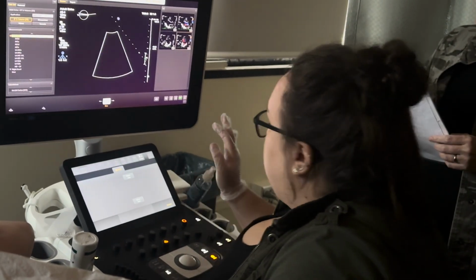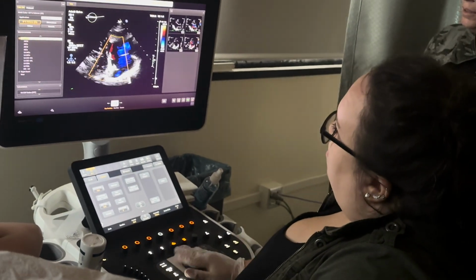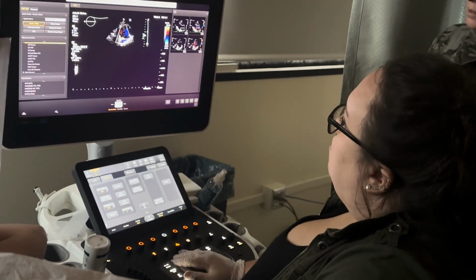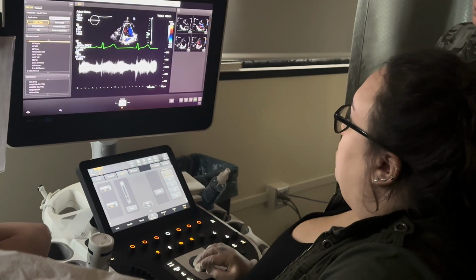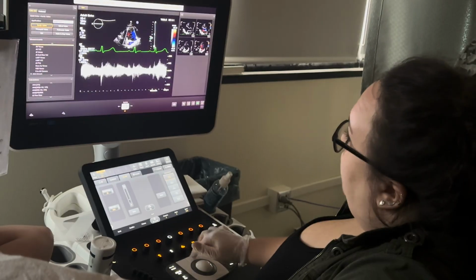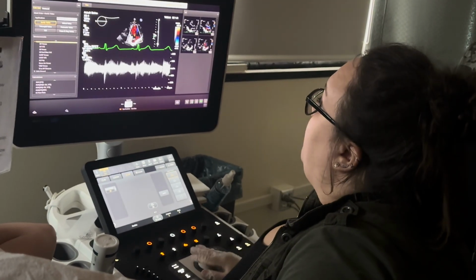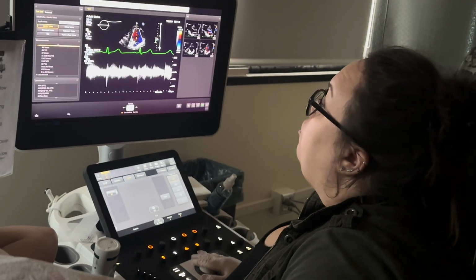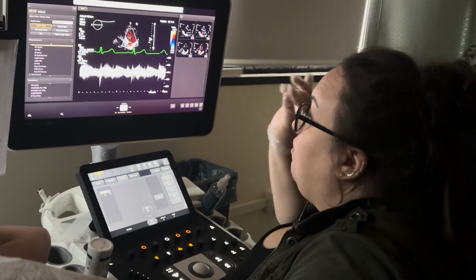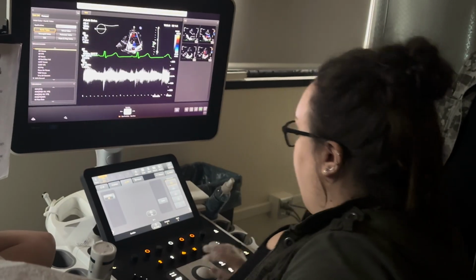And then this is when we do continuous wave. Hit my CW. Now, just like with carotid, you can hit this middle button above your cine ball to take you back to your duplex image. That way you can make sure you are right in between the valve leaflets and picking up that regurgitant flow.